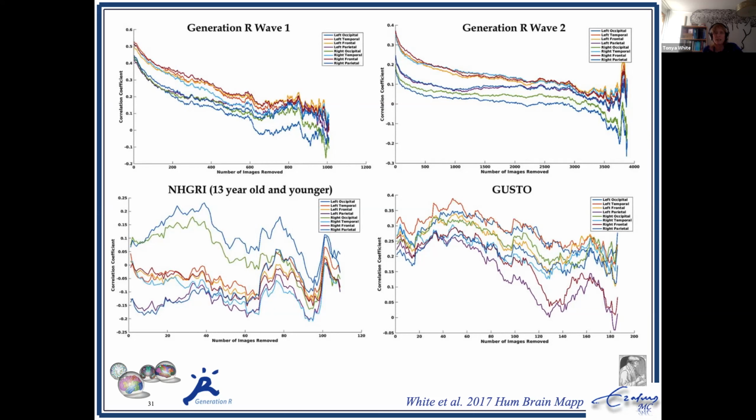The automated quality assessment follows the cortical thickness measure. But the quality assessment was based on the raw T1 MRI, right? Right, it was not based on any of the measures outputted by FreeSurfer, one of them being thickness. So I think I'm missing a link. Why do you want the correlation between the gradient score and thickness to be 0, rather than 0.5? How does this relationship help us with quality assessment? That's what I'm trying to follow. It seems like there are a few leaps happening here, assumptions that need to be more explicitly stated.